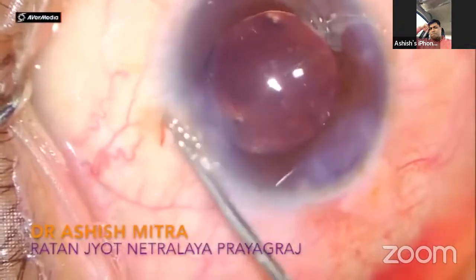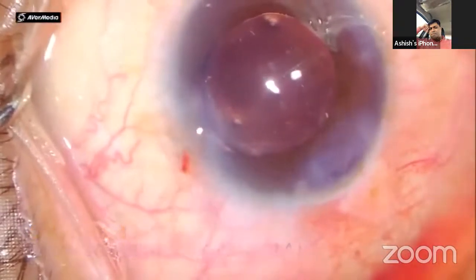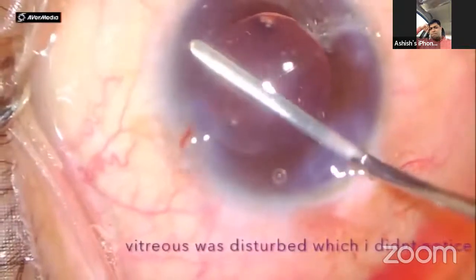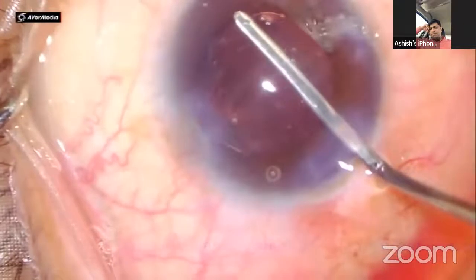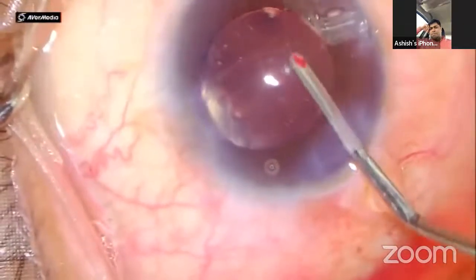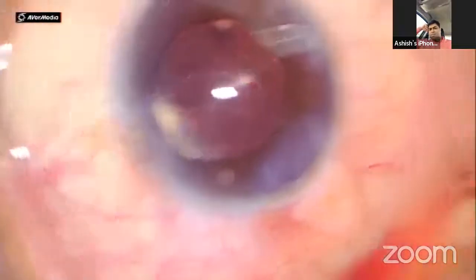See again, that clot is engaged with a thread-like fluid, and that is the reason why my lens was shifting to one side, because the vitreous was coming from the zonular dialysis side through this port outside.